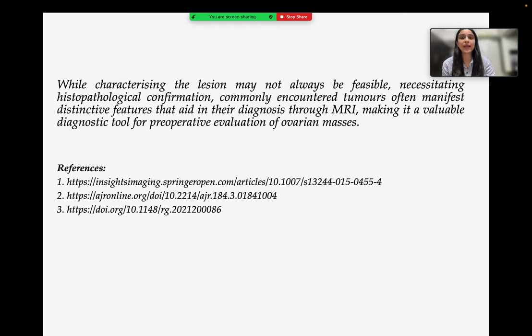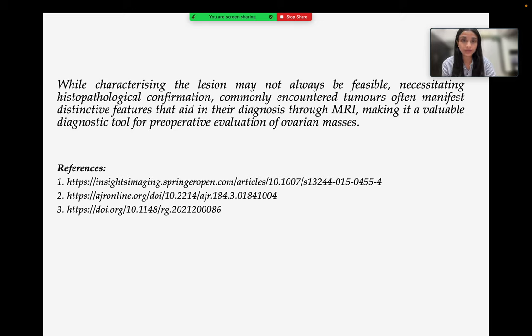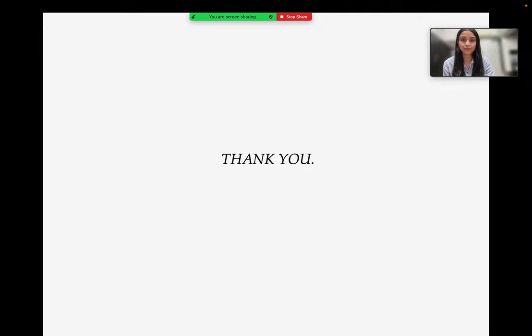While characterizing the lesion may not always be feasible, necessitating histopathological confirmation, commonly encountered tumors often manifest distinctive features that aid in diagnosis through MRI, making it a valuable diagnostic tool for pre-operative evaluation of ovarian masses. Thank you.